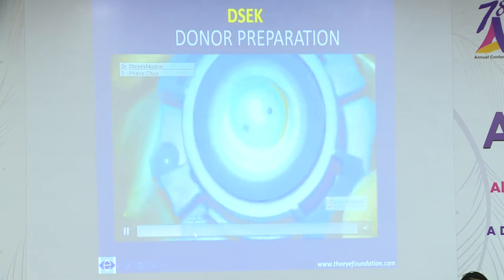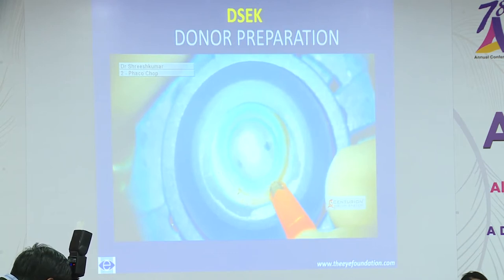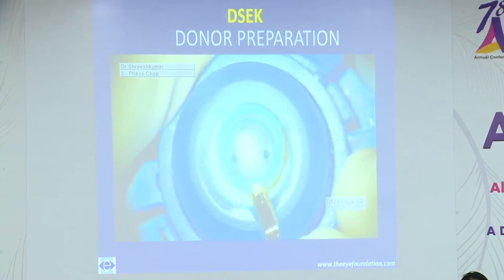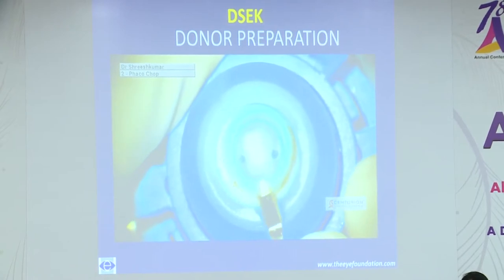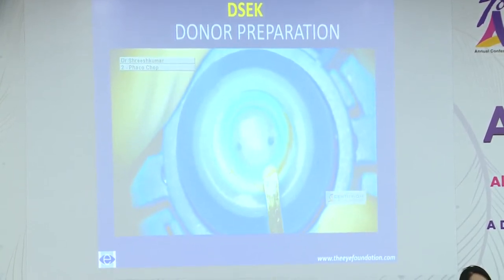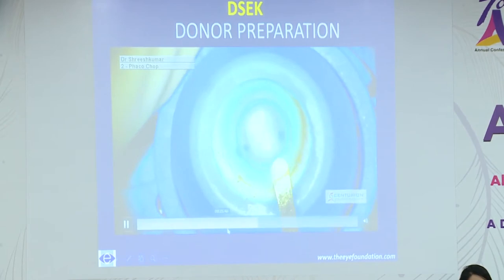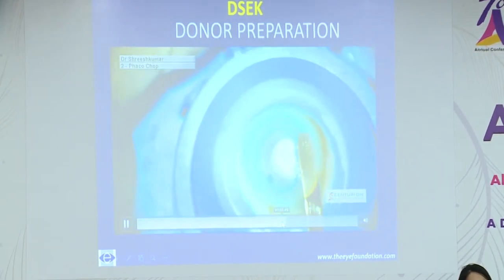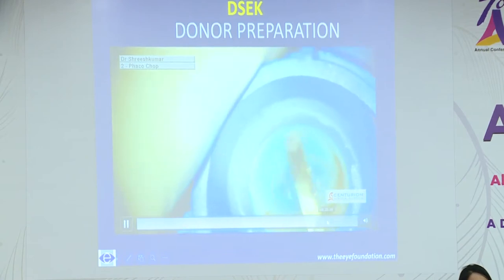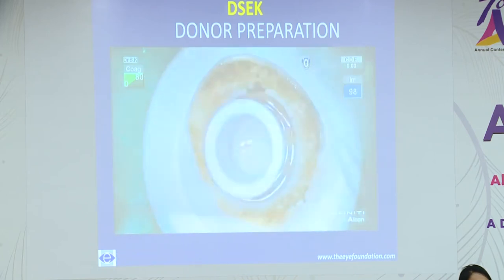Then I use a guarded knife to make a partial thickness groove at the limbus, which is around 300 microns. You can even go up to 400 microns. I use a crescent knife to make a small pocket in the stroma of the cornea, and then use my blunt dissector, which has a sharp margin in the tip, and the side is a blunt side lamellar dissector. Once the dissection is completed, I place it on the Teflon block and punch it with the endothelial side up.